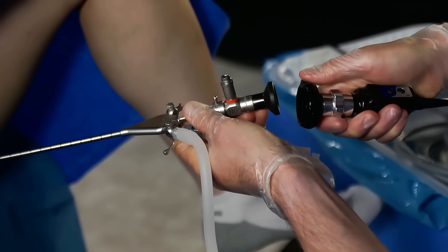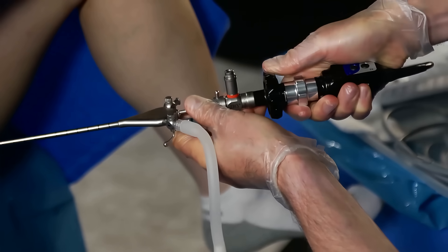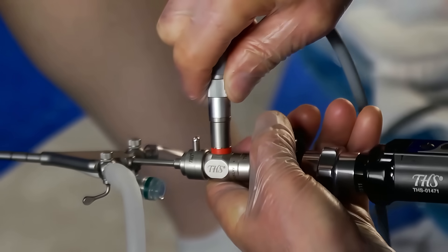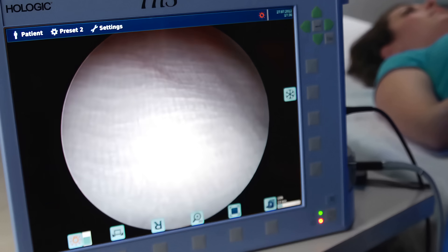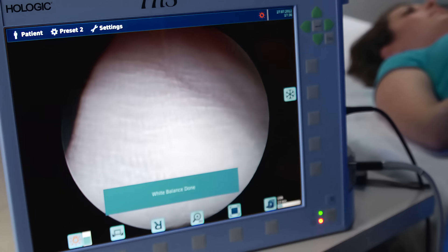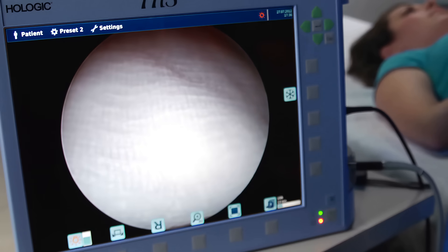The camera head is placed onto the hysteroscope. The light source is then attached; at times this may require an adapter. Once confirmed to be locked in place, the light is kept off until in use, as heat from the light at the tip of the hysteroscope could cause a burn on either the patient or on the drapes where it is resting. A white balance is then performed by hitting the camera button while focusing on gauze or other all-white surface. This is done with the light fully illuminated from the light source.